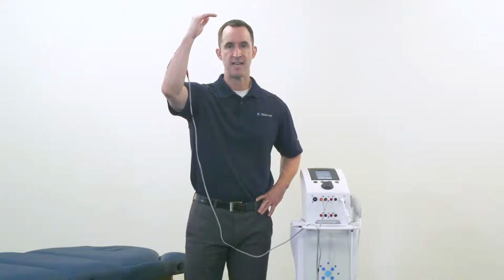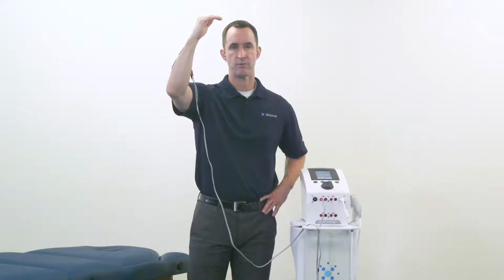The ramp time is the amount of time that it takes to get from 0 milliamps to your set milliamp or amplitude for the physiological response you're looking for, and then the amount of time it takes to come back to 0 milliamps. Let's take a closer look at how we can set up a quick demo so you can physically see this in action.